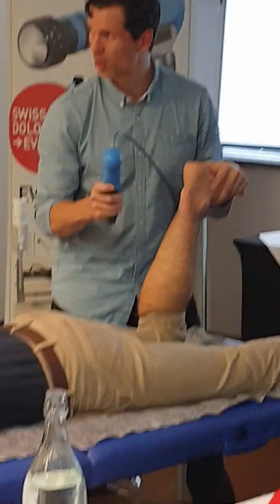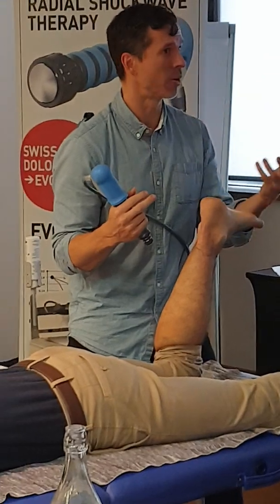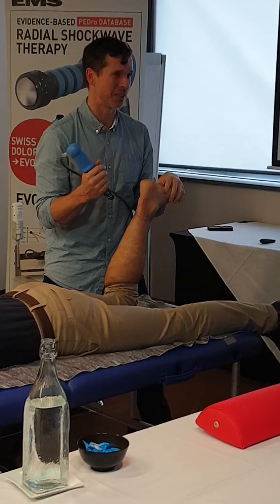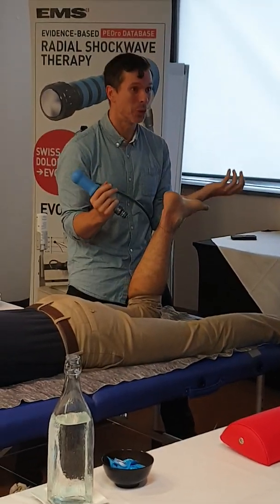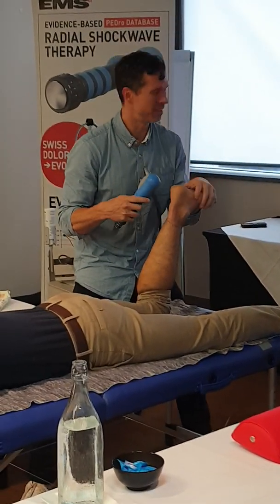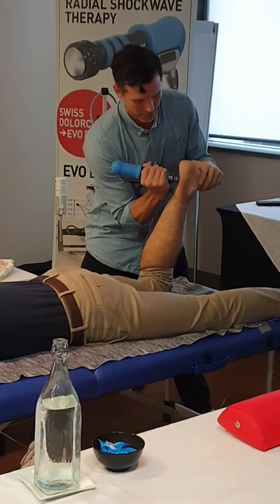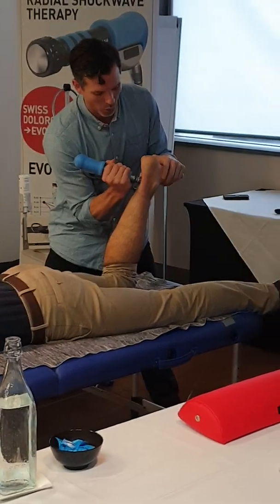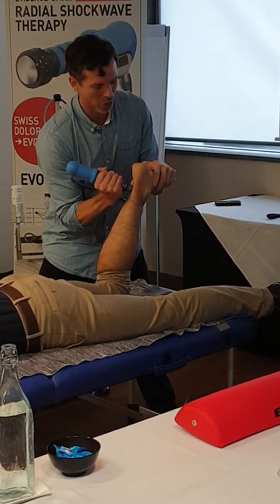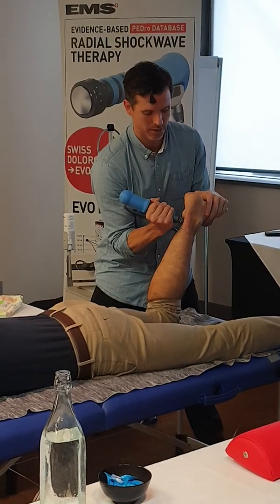And don't be afraid. You don't look stupid if you keep asking the patient. Most patients will think you're actually being a caring practitioner, right? We all kind of get in our heads, oh, I don't want to ask too many questions because it seems like I don't know what I'm doing. Patients don't usually think that. They usually think he's trying to find the spot, right? Don't be afraid, and the more you ask, the better you'll treat, because you get more feedback. Then you start to correlate what you feel with the feedback, and you'll get better at feeling spots, okay?